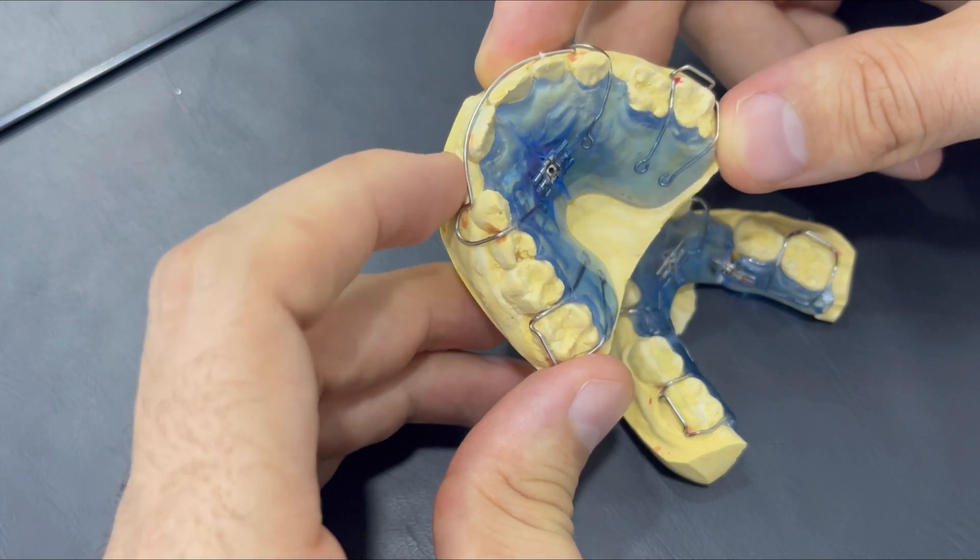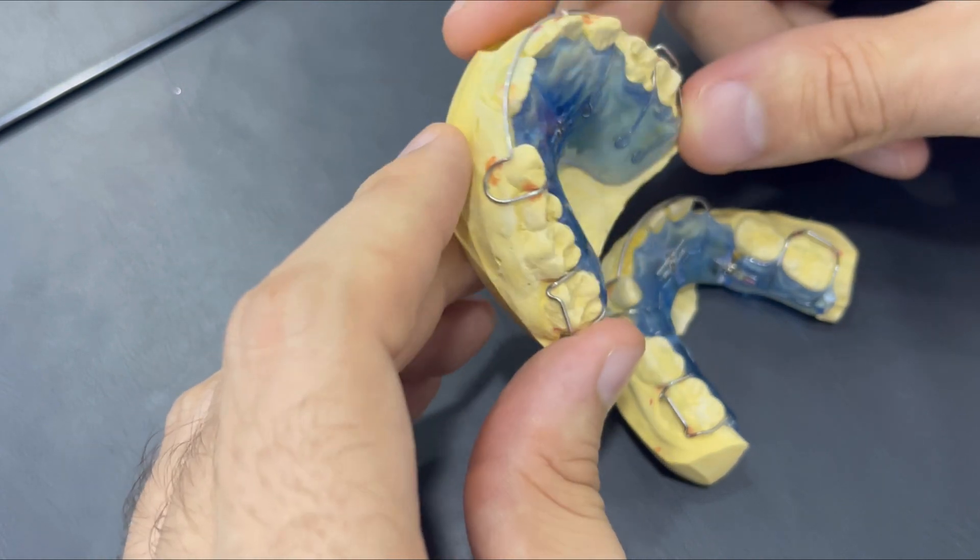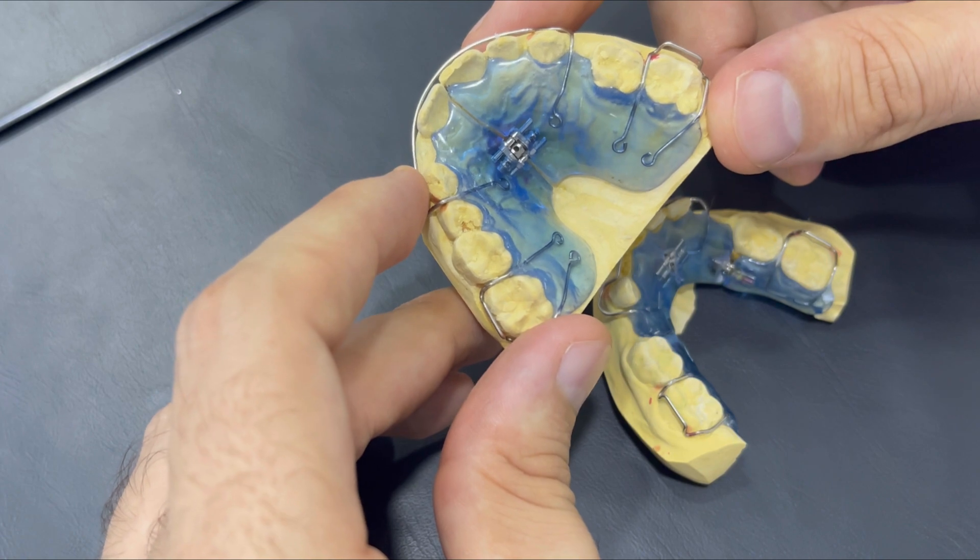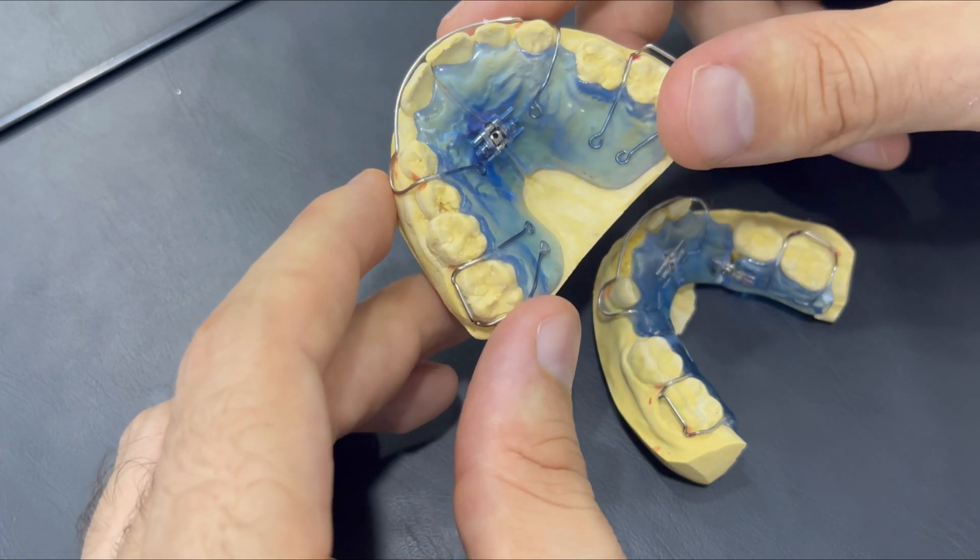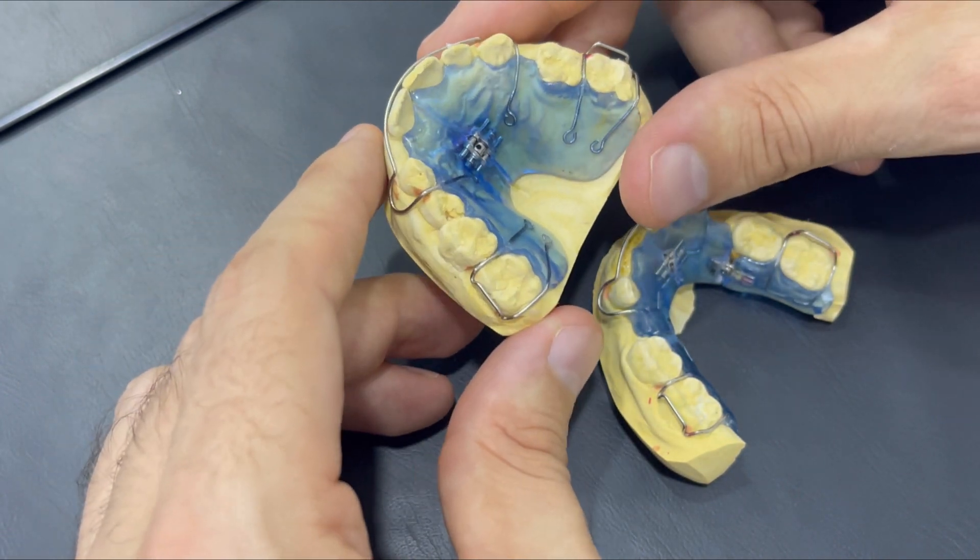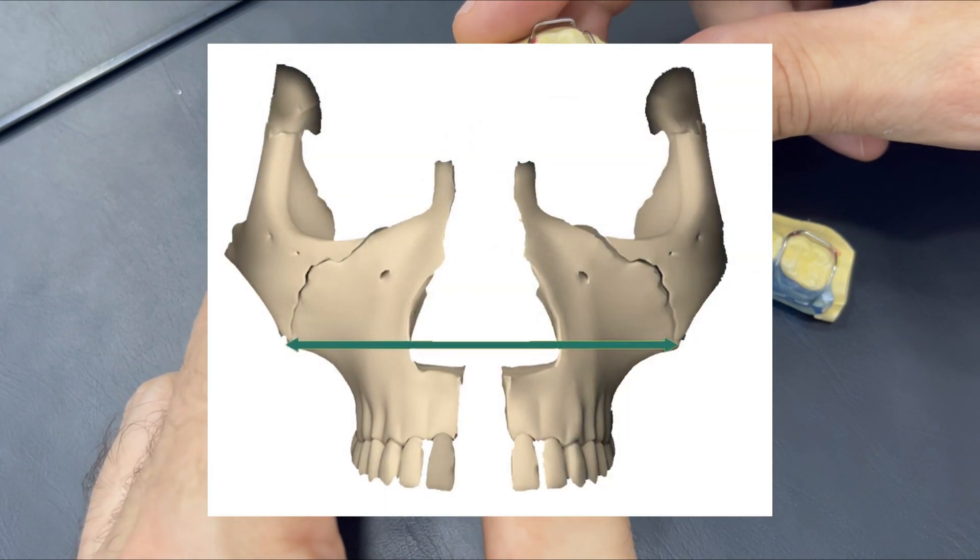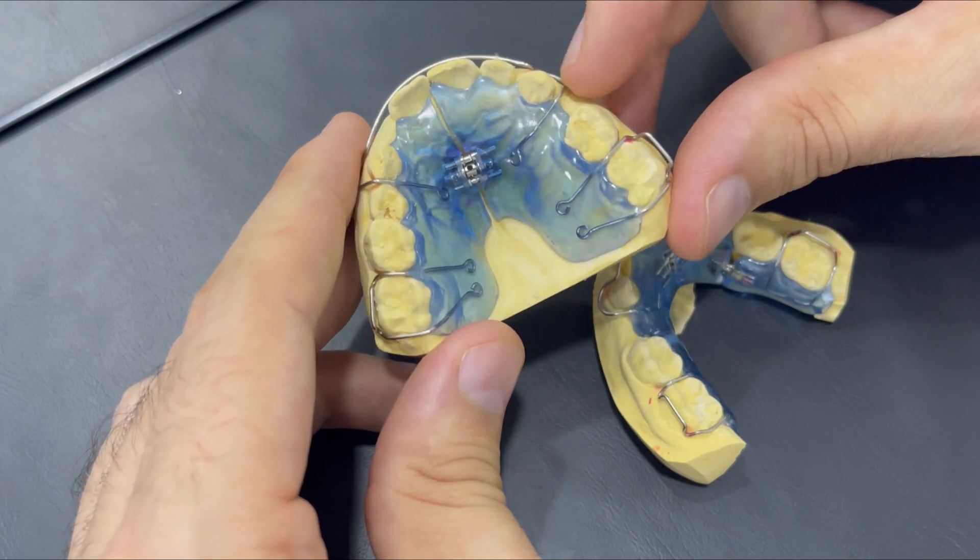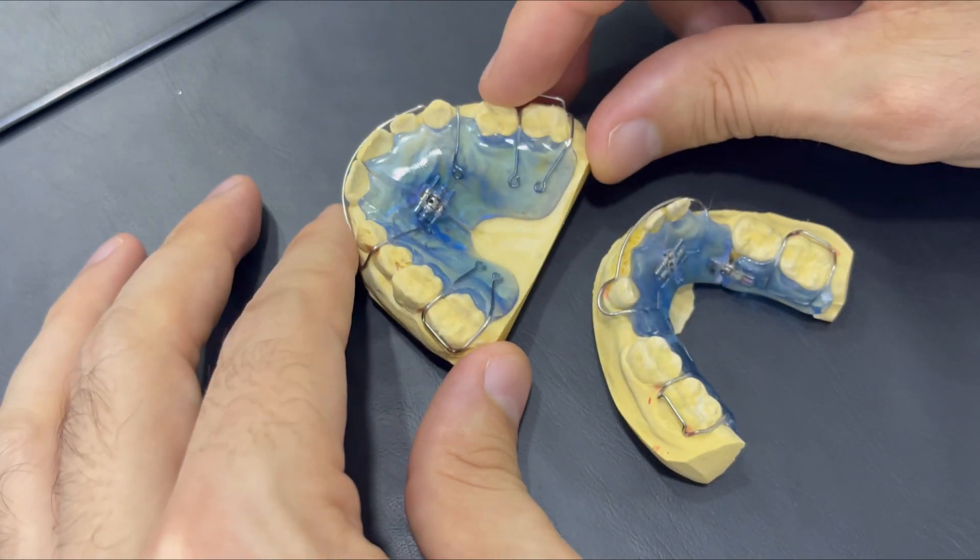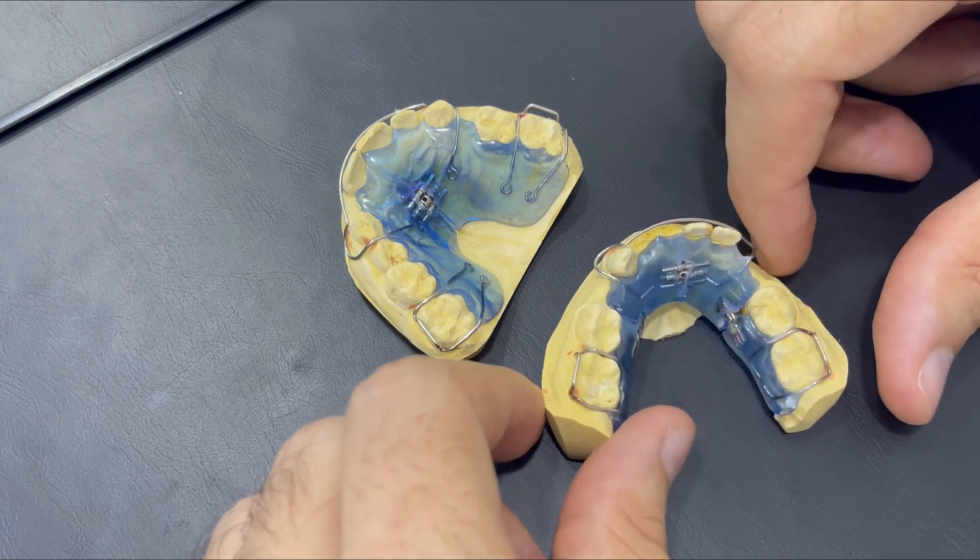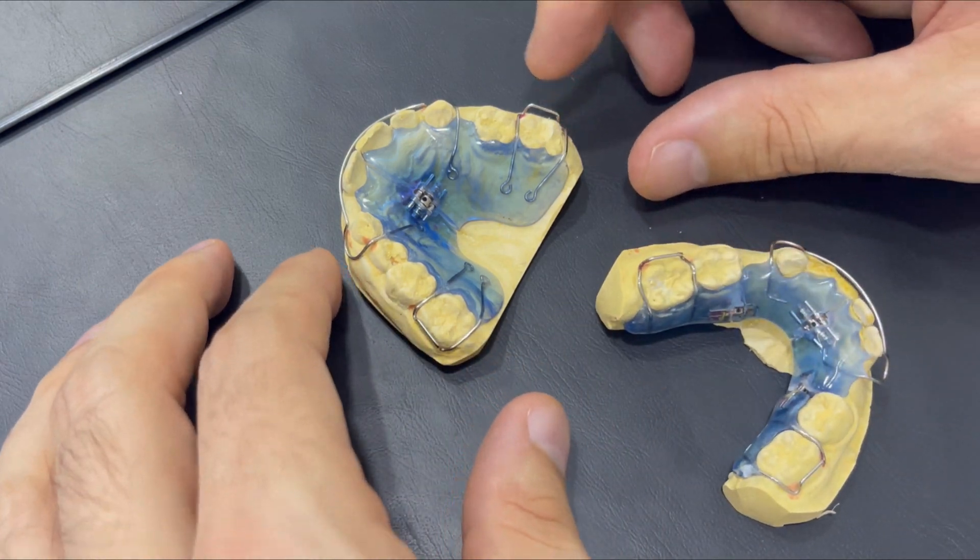The difference between fixed appliances and removable ones is the dental expansion or the skeletal expansion. Skeletal expansion means expanding the bone itself, in comparison with removable one which is expanding only the teeth. In other words, inclining the teeth outward.